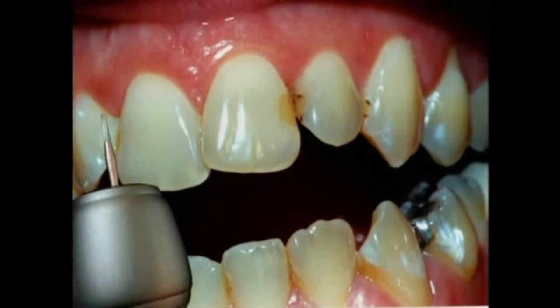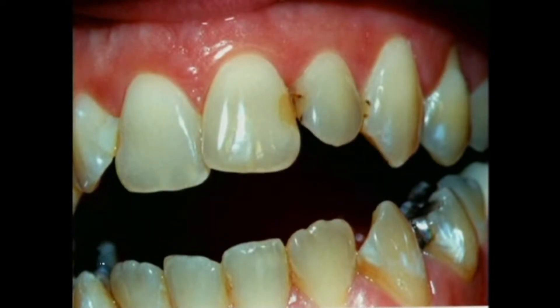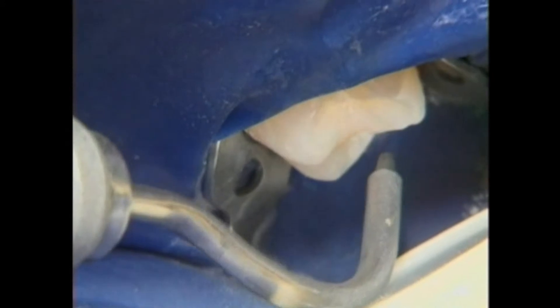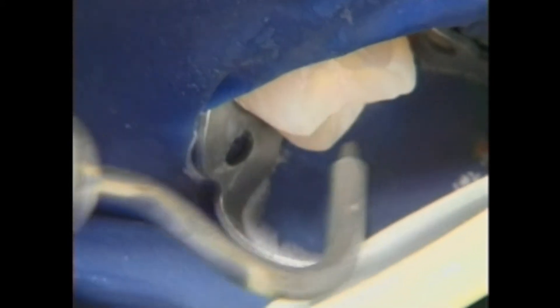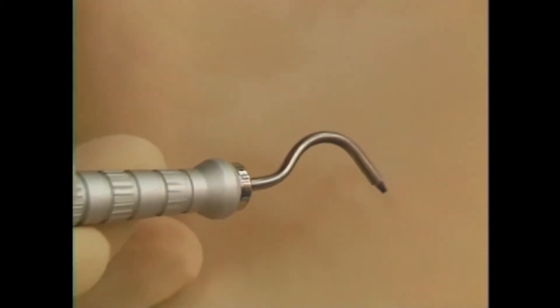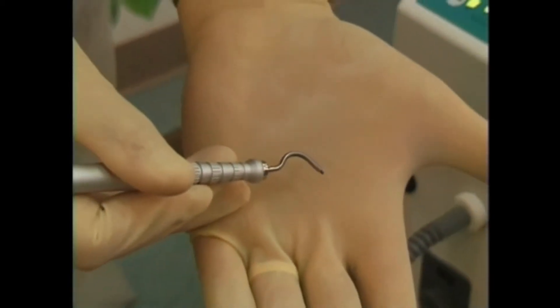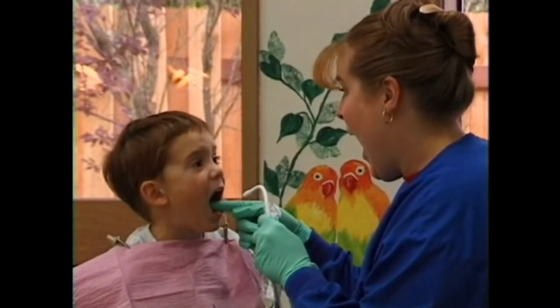Until recently, there was only one way to remove decay in teeth — with the traditional dental drill. Today we're fortunate to have a new option that in many cases allows us to work without physically touching the tooth. This new technology is called air abrasion. Air abrasion involves the use of a special handpiece that creates a beam of abrasive particles propelled by a stream of clean, dry air.